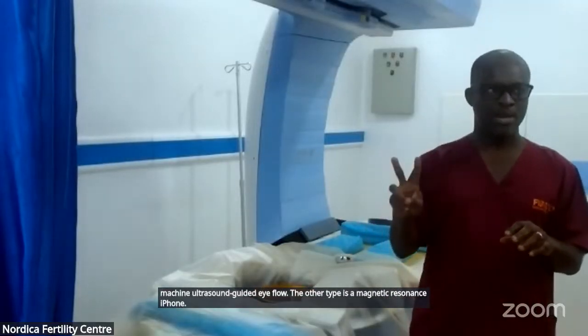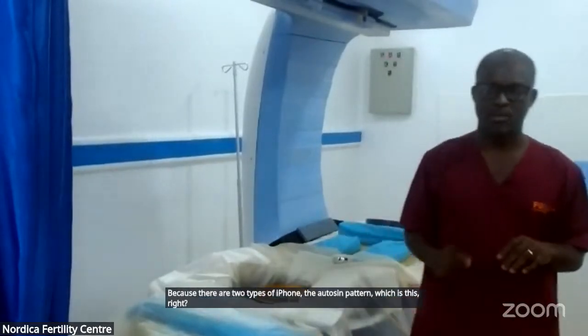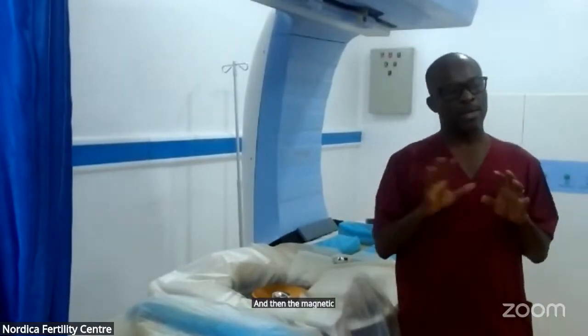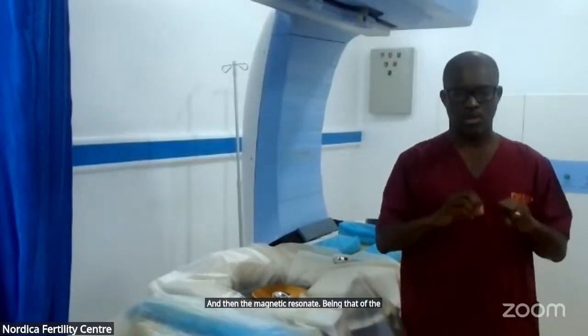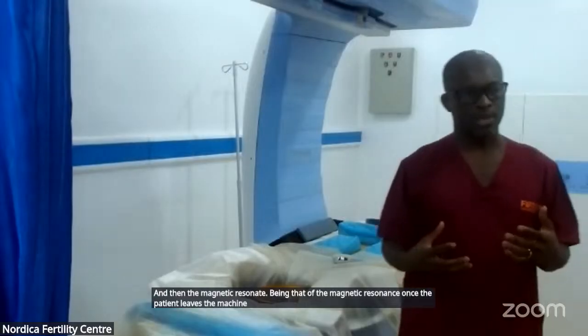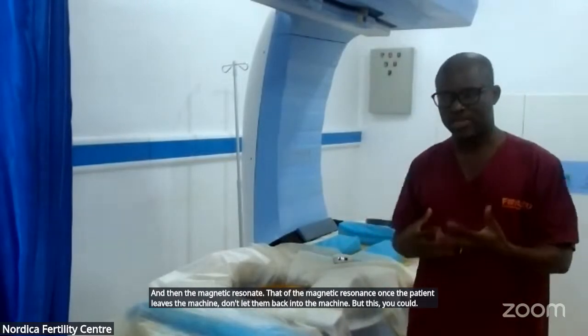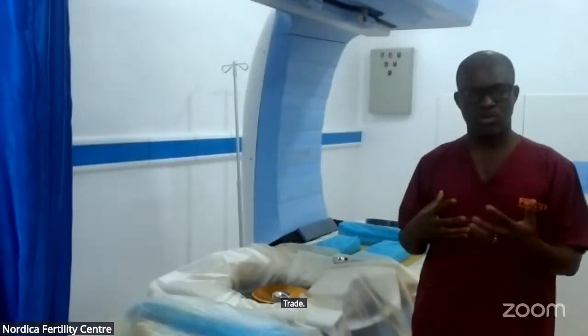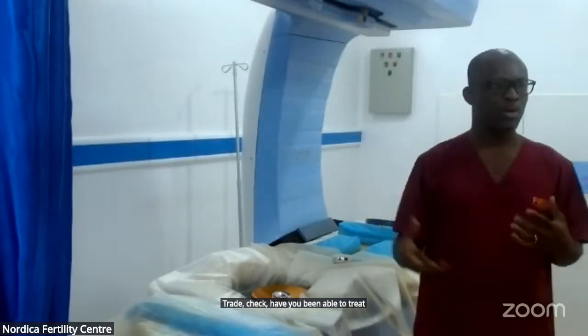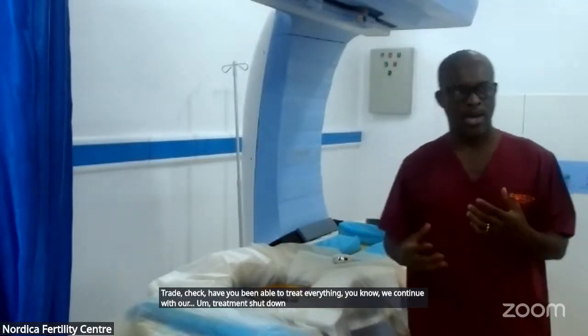With the magnetic resonance type, once the patient leaves the machine, you don't take them back in. But with this, we can check whether we've treated everything and continue until all the fibroids are treated.